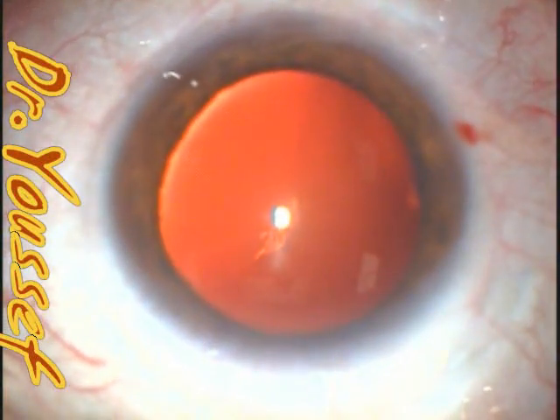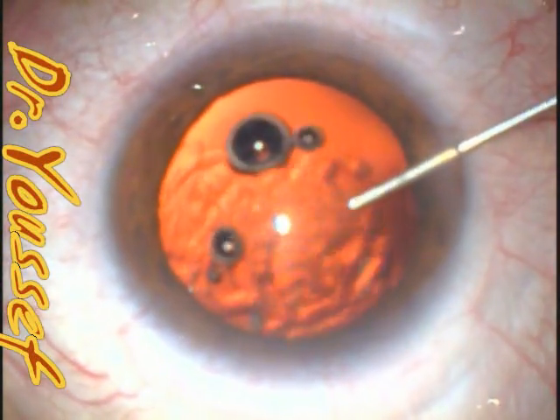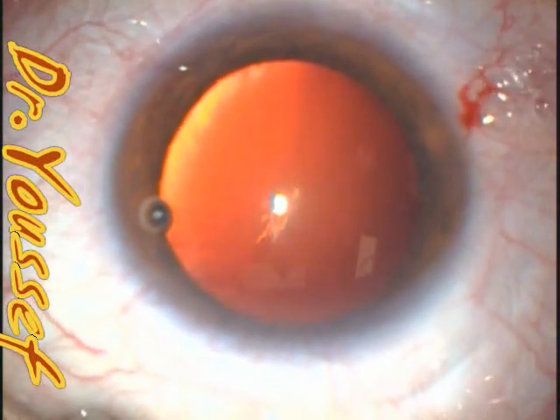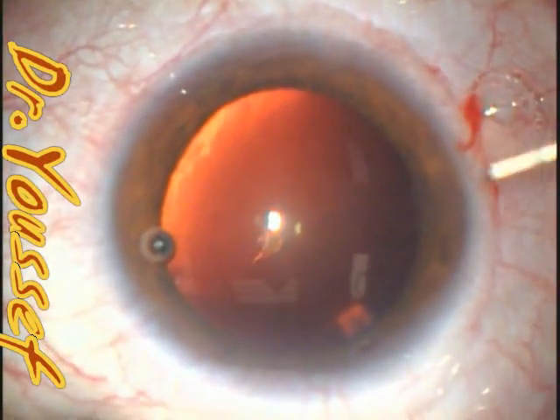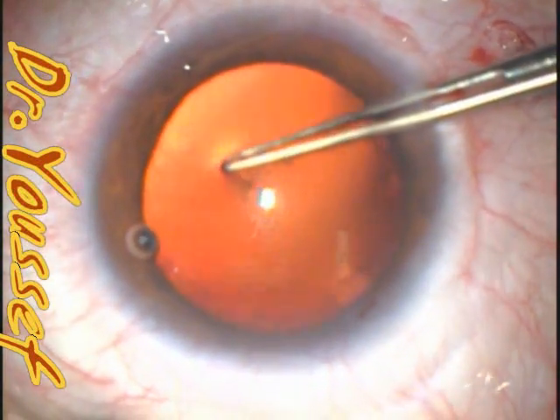I've received quite a few referrals for pigment dispersion syndrome secondary to lens implants — single-piece lens implants being placed in the sulcus. The primary surgeon simply was not sure that the haptic was in the bag and did not discover this complication at the end of surgery.